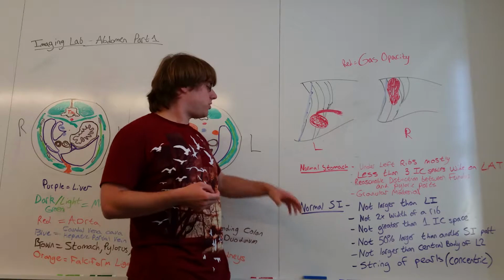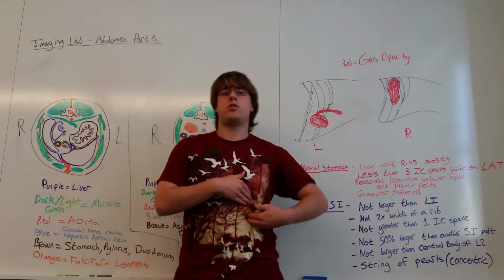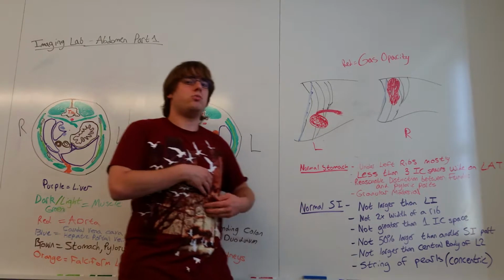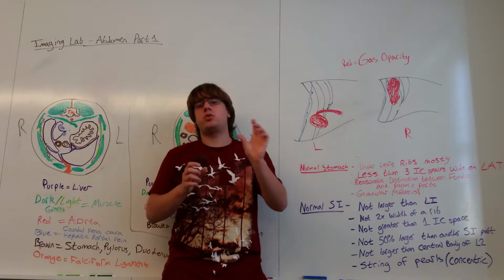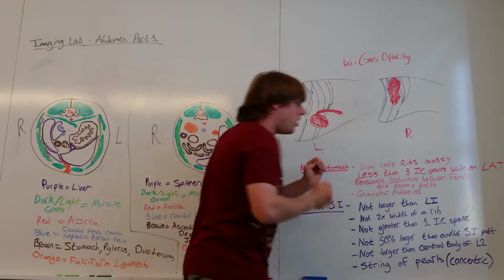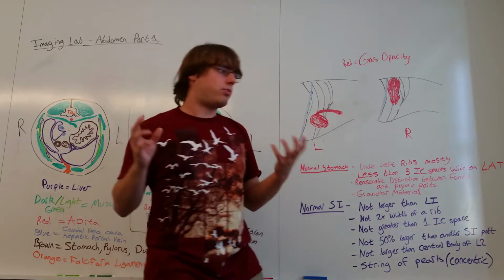On the other hand, stomach and small intestine, they actually gave us measurable margins for judging whether it's healthy or not. So the stomach, first of all, should always be a left-sided organ, so it sits under the left rib cage. And if it's extending beyond that rib cage, there's probably an issue. Most of it should sit under the rib cage. Furthermore, it should be at most about 3 intercostal spaces wide when you're looking at it from a lateral view. So if it goes beyond that, you know you have a problem. You should also be able to recognize the fundus and the pylorus normally on a regular radiograph, although they might become even more prominent when you have a problem.